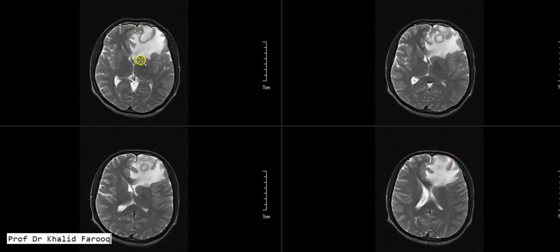Contralateral midline shift is clearly appreciated and there is mass effect on the frontal horn of the left lateral ventricle. The abnormal signals extend and involve the corpus callosum anteriorly, especially on its left side.